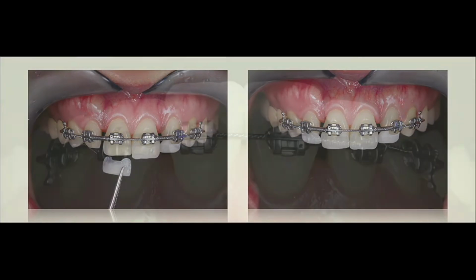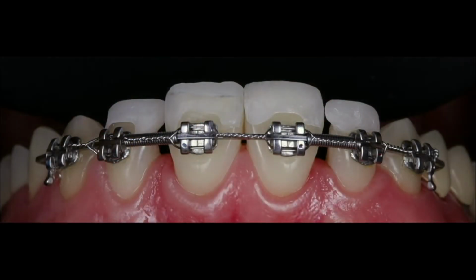Now, when I position those, as you can see, it tells me all the things that need to be done orthodontically due to my 3D design. What does it tell me? It tells me where to position my lateral, mesiodistally. It tells me where to locate my lateral buccolingually to be minimally invasive.